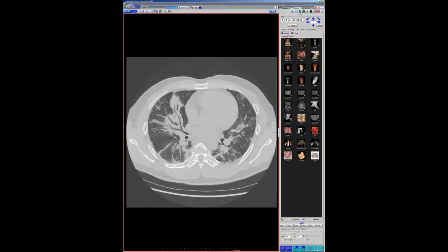Right, and I think that's a point. If we do see that with a pleural effusion on a two-view chest, I think there you can say consistent with infection. I think that's where it's useful, saying, okay, the likelihood this patient has COVID-19 accounting for their symptoms is actually very, very low. Right. But has anyone talked about flu? We always get superinfections with MRSA. Has anyone seen superinfections, bacterial infections, on these cases yet? Not that we've recognized.